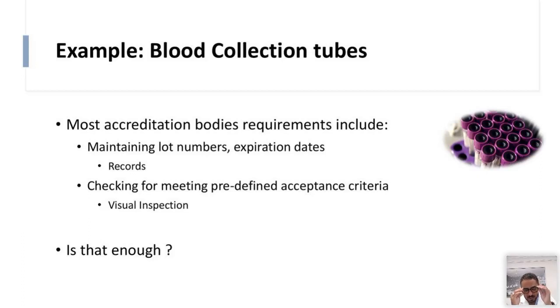Look at how much we subject our internal processes to, like if you have a hematology analyzer and want to produce a CBC result, you make sure you are covered by quality control, you do the calibration, you are enrolled in a PT program, and you do corrective action plans. You subject it to a lot of your internal resources to assure you get a valuable result at the end.